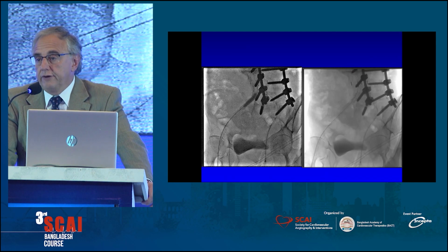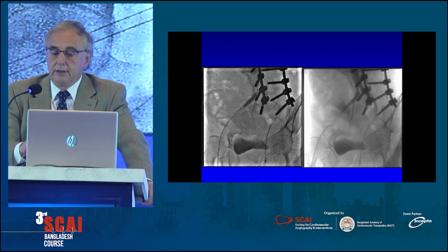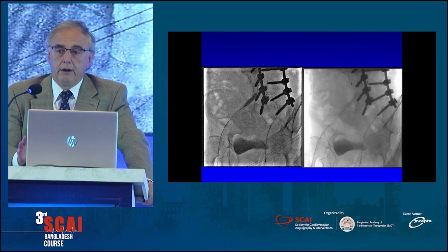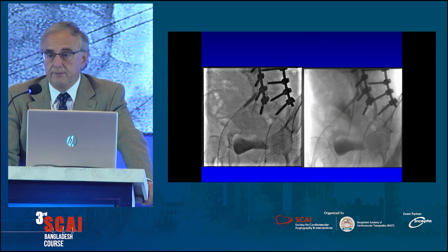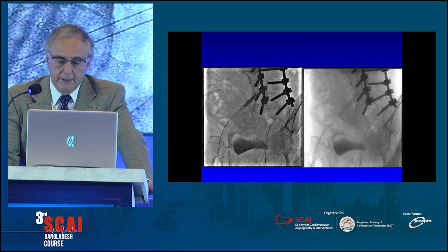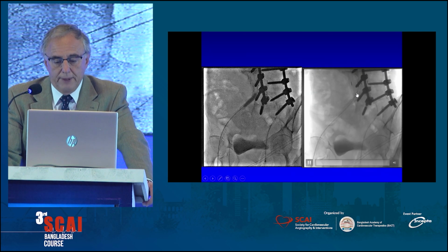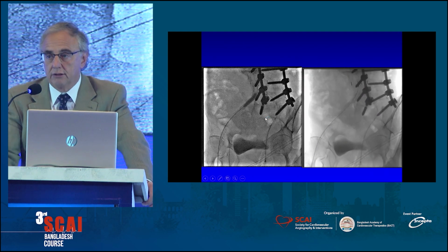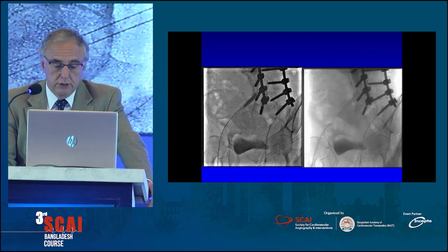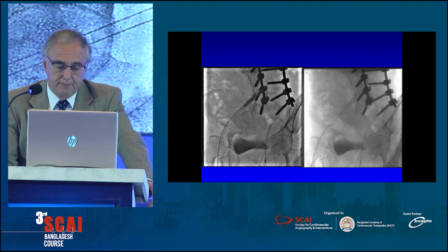So this is a very risky perforation. It's not like in the heart that will drop a little bit. This will drop a liter of blood in less than a minute, because it's a very sizable perforation. Unfortunately, I didn't have the balloon in the patient because I didn't expect that this perforation would happen. If I had paid attention to the calcification, it was very calcified, and I did a reverse CART. Probably this is what produced the hole when I put the stent. With the balloon, nothing happened.